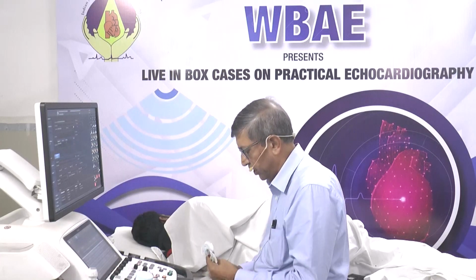Both percutaneous and surgical AVRs have been done. So with that in mind, we need to have accurate data so that we can choose our patients correctly and get the right morphology of the aortic valve to aid in the management of the patients. So before we start, there are certain basic things that I would like to highlight.